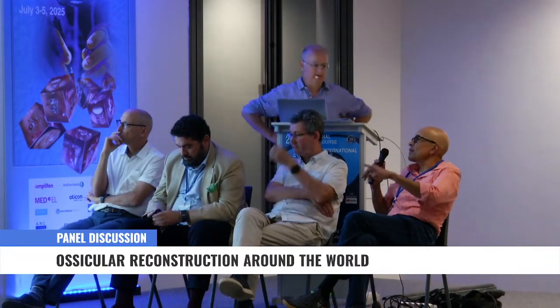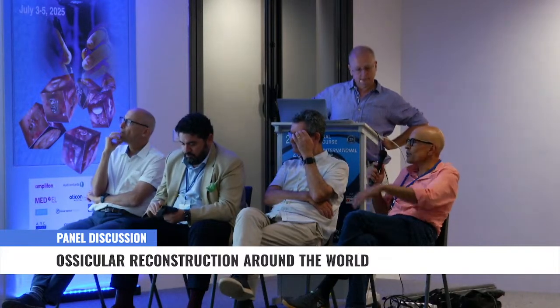Well, with the cartilage cap. Yeah, with a cartilage cap. And I use the scutum and the malleus intact to lock it into place. If the mucosa is very inflamed and diseased, there'll usually be a medialized malleus. And I'll tend to use cartilage then, type 3.